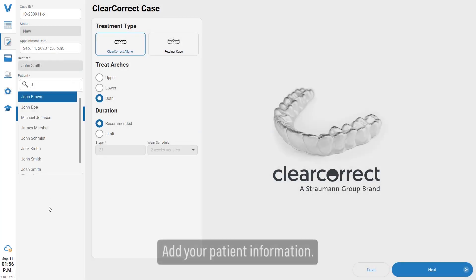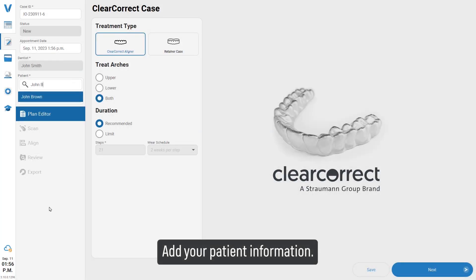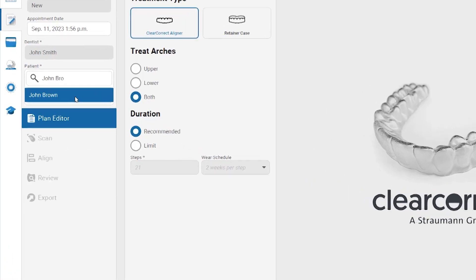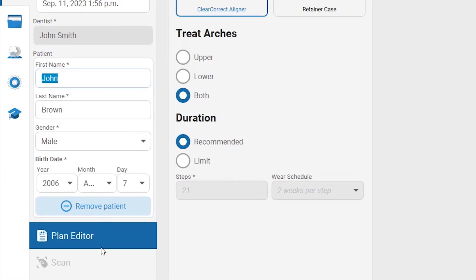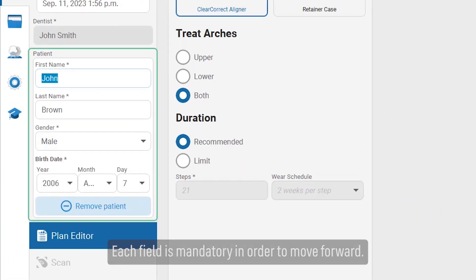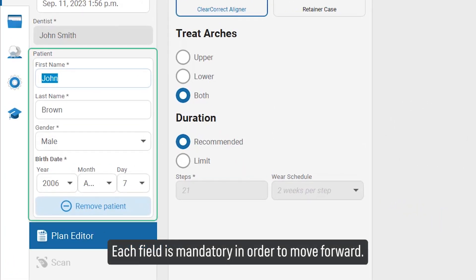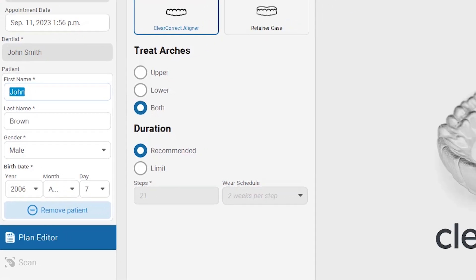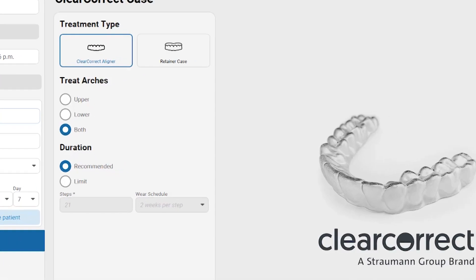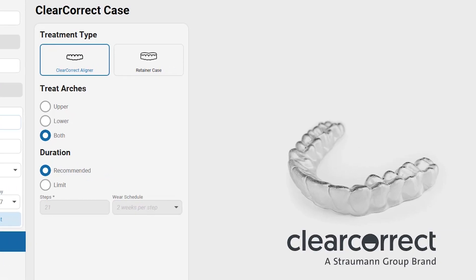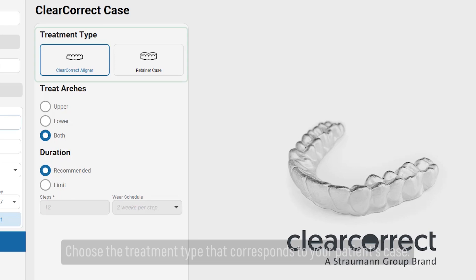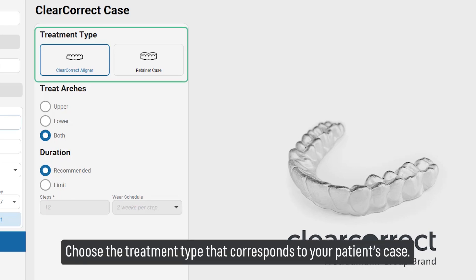Add your patient information. Each field is mandatory in order to move forward. Choose the treatment type that corresponds to your patient's case.